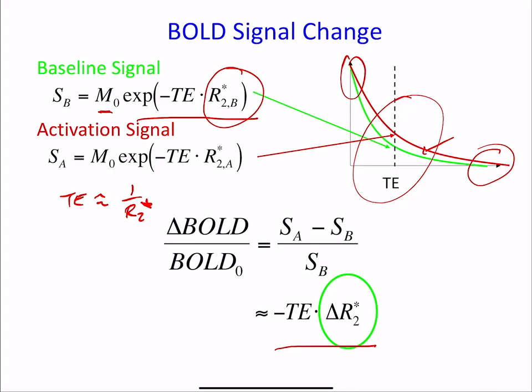It's something you can predict with modeling. You can actually measure it as well. You can acquire the image at different echo times and see how it decays. Typically, a few groups will measure it really carefully, and then everyone else will just use those values, unless they find a diagnostic reason to measure them in a person. People are always looking for new biomarkers, so it is conceivable you would measure it in a single person, but typically, if you're just doing a research study, you do what everyone else does, as a first step.